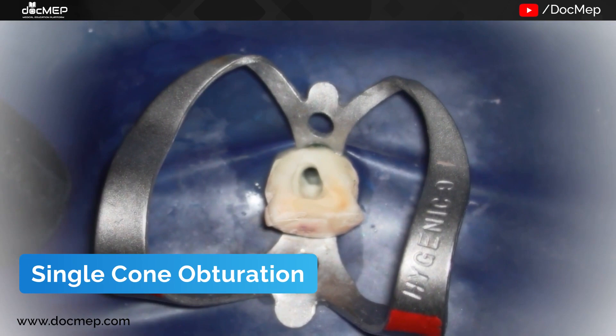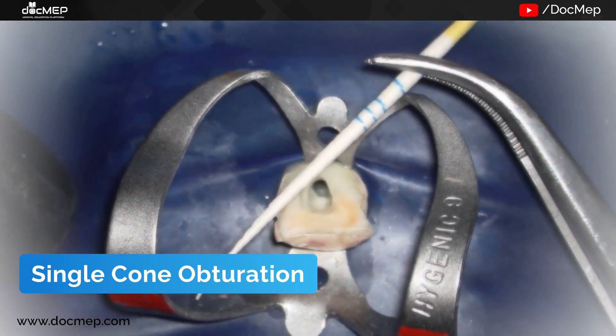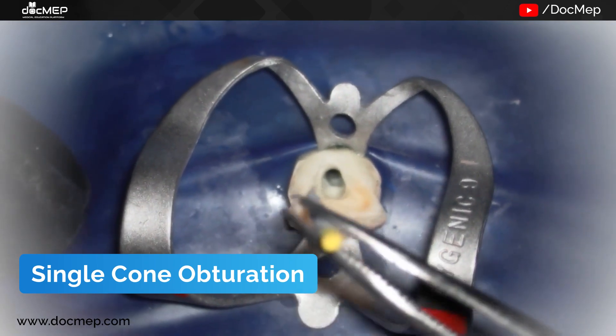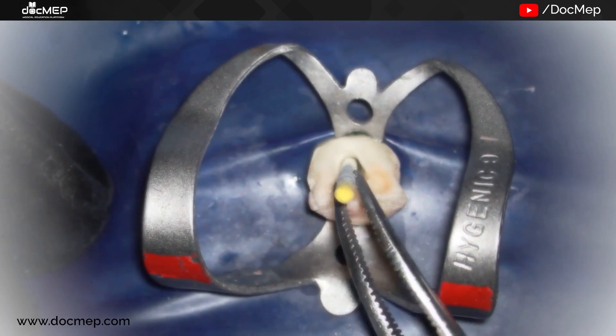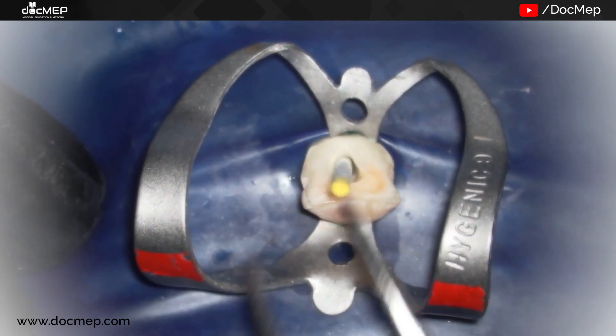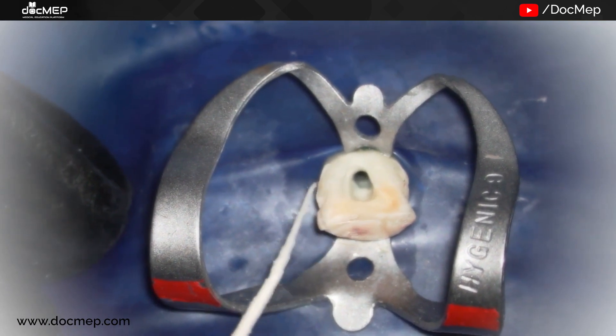We dry the canal using our paper point, preferably of the same size as our last file, right till the working length. You can see how the paper point bends when it is wet.